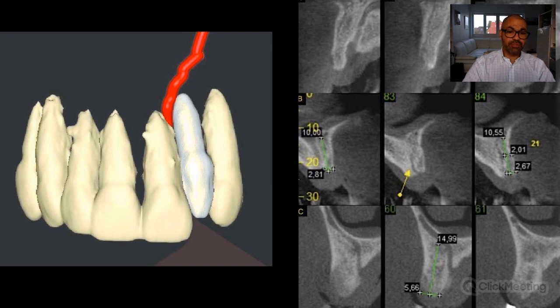Here you see another example on the right side where this canalis sinuosus can be seen. And it's not that it's super tiny. Sometimes it can be bigger, sometimes it can be smaller. But we need to know that this structure is prevalent.